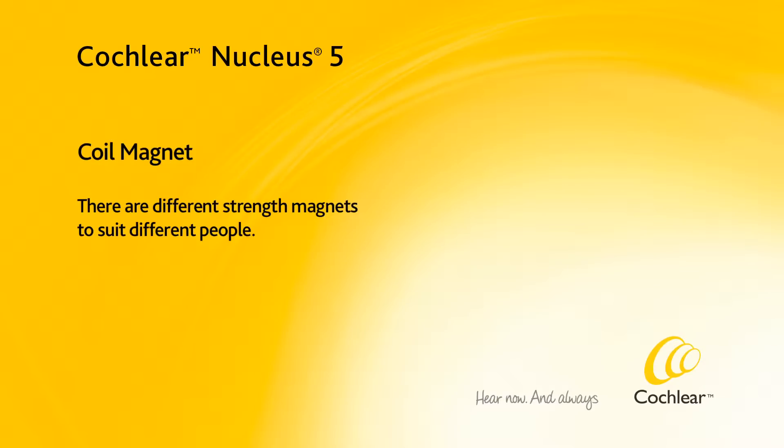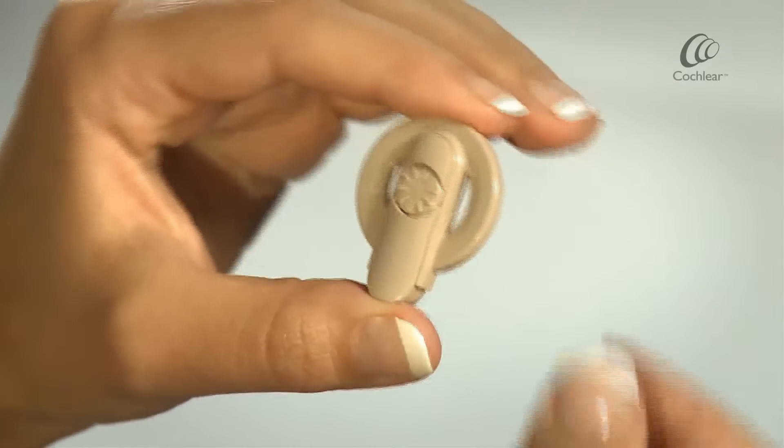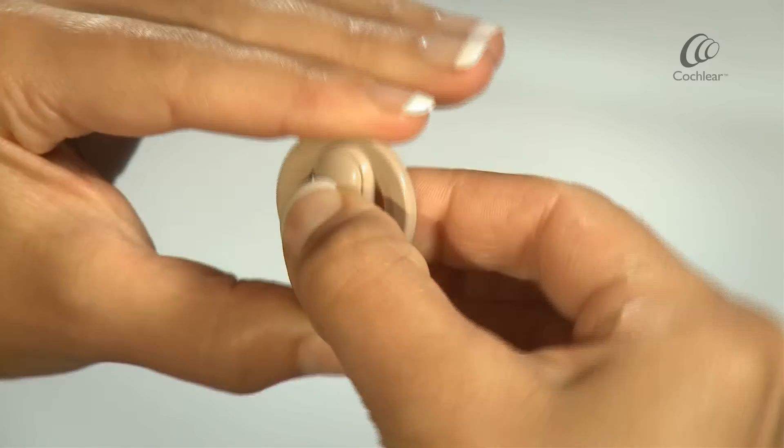There are different strength magnets to suit different people. To remove the magnet from the coil, turn the magnet anticlockwise.